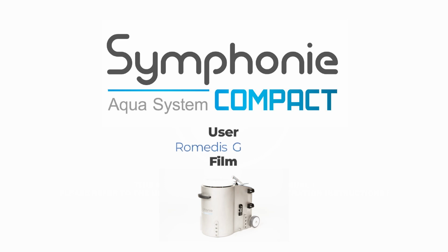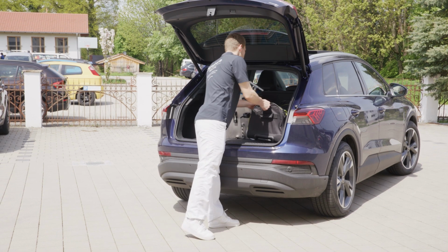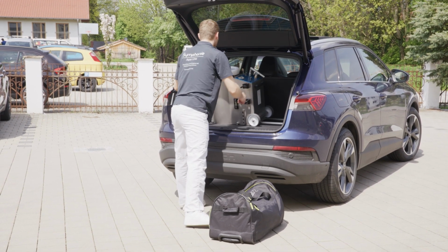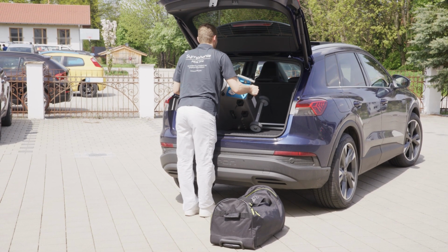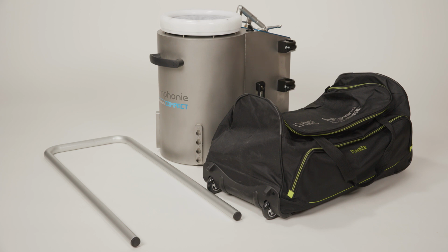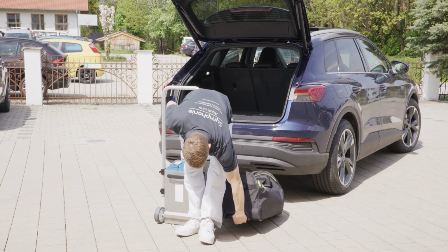The following film illustrates the use of the Symphonie Aqua compact system. For a detailed step-by-step introduction, please refer to the user's manual. The compact system is designed with mobility in mind, so it can be easily disassembled and transported to any location. Make sure the system is placed on an even and dry floor, and you have access to clear water.